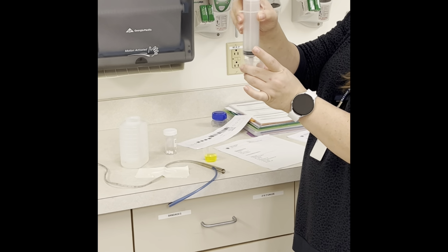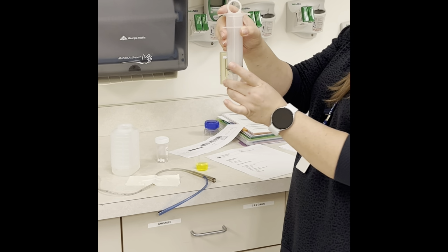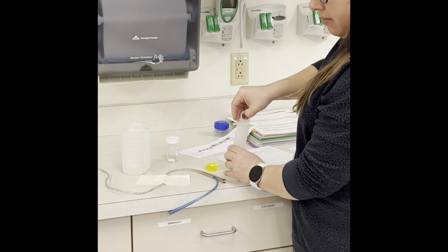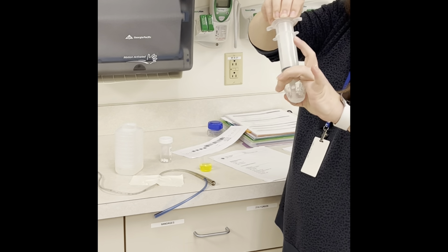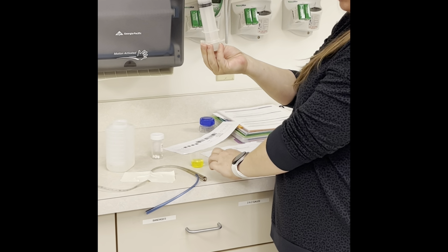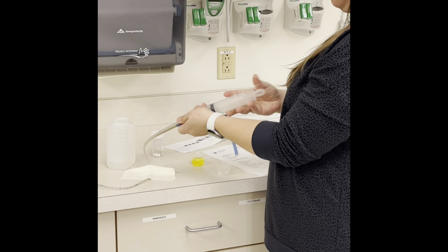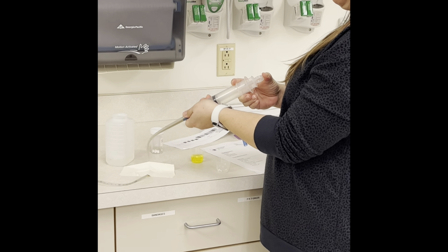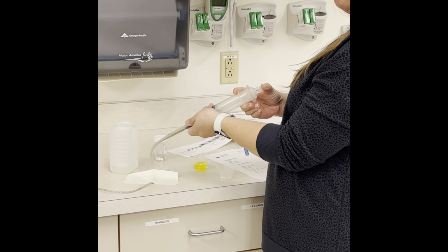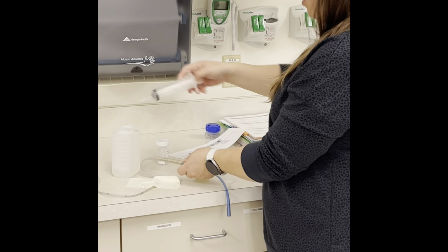We're gonna mix it till our pill is dissolved. You're then going to draw it up. You may need to put it on an angle to get all of it in there. So all the medication's in there. Uncap our tube. We're just gonna push it slowly through there. Okay. Cap it.